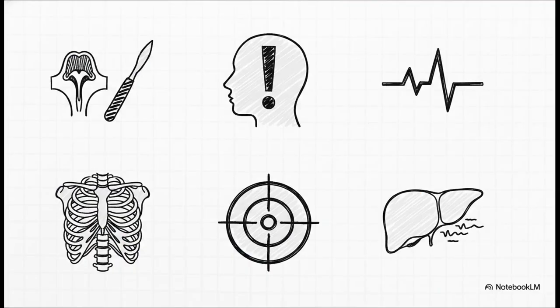So the number one reason, the classic indication, is obviously airway surgery. It gives the surgeon an amazing tube-free field to work in. But it's so much more versatile than that. It can be a literal lifesaver in a can't intubate, can't oxygenate emergency. It's used in thoracic cases with leaky airways, and it can even be used to create an almost perfectly still operating field for super delicate procedures like ablating tumors or cardiac arrhythmias.